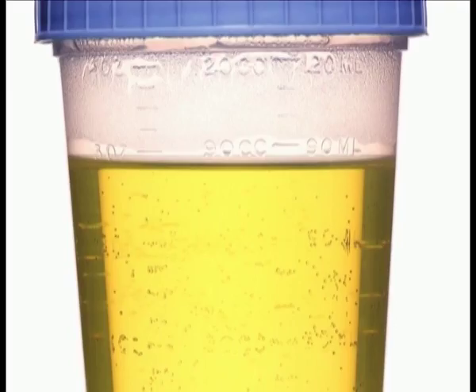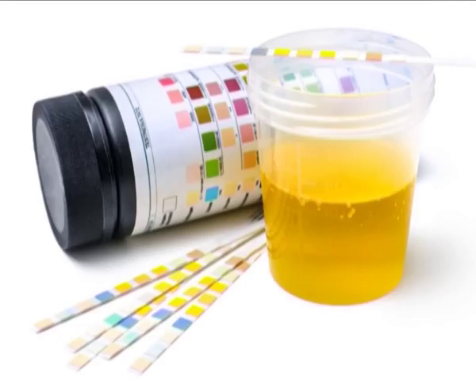The target parameters that can be measured or quantified in urinalysis include naked eye, that is, gross examination for color and smell, plus analysis for many substances and cells, as well as other properties such as specific gravity. A part of urinalysis can be performed by using urine test strips, in which the test results can be read as color changes. Another method is the light microscopy of urine samples.